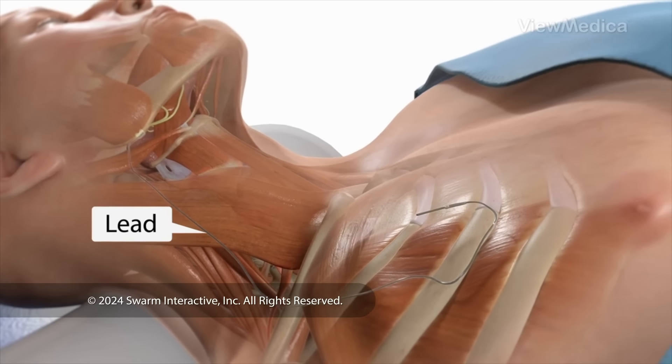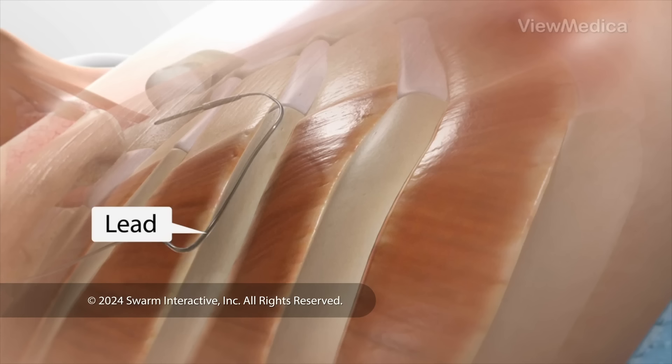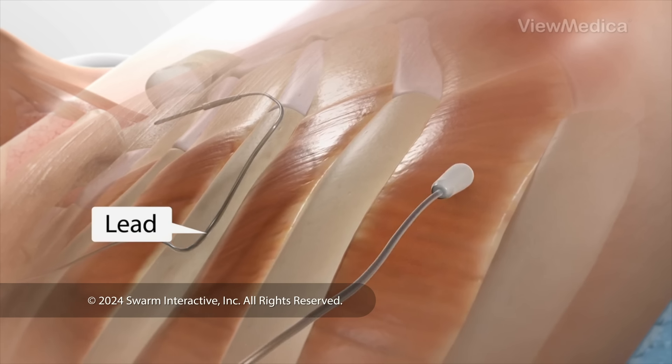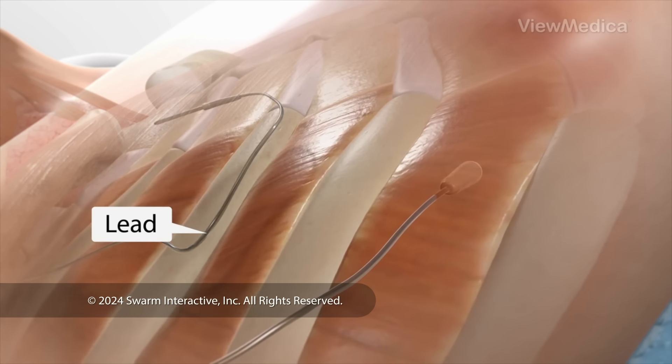Next, we implant the second part of the device — a lead that contains a breathing sensor. We make a small cut on the side of your chest and put the sensor near your rib muscles. It monitors your breathing by tracking the movement of these muscles.